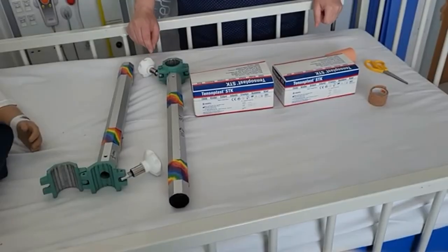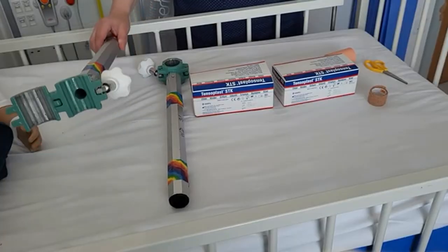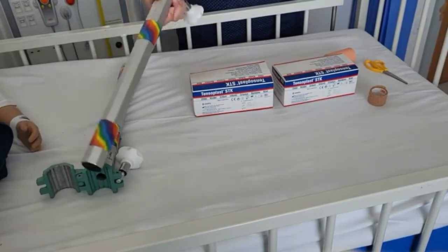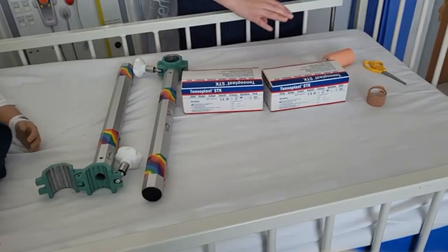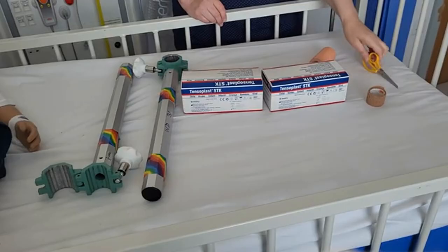This is the equipment that you need to apply gallows traction to a child in a cot: two poles with brackets to attach to the cot, two sets of traction kits, some tape and some scissors.